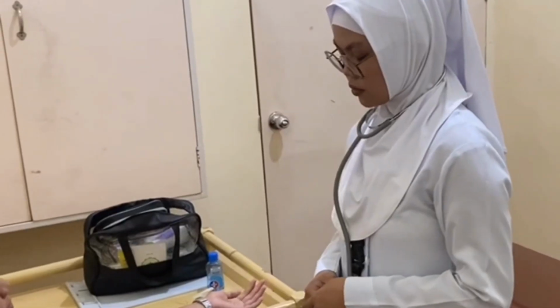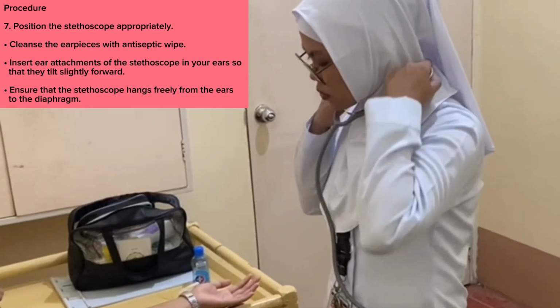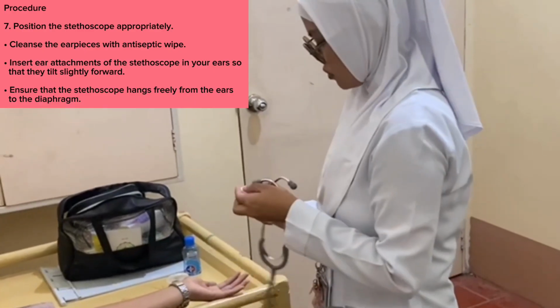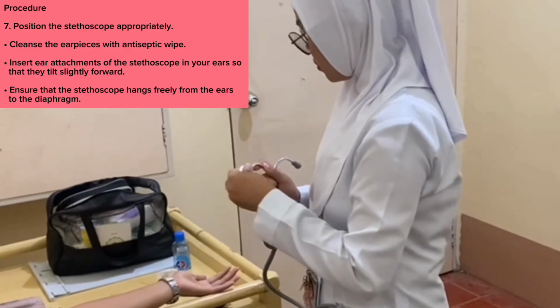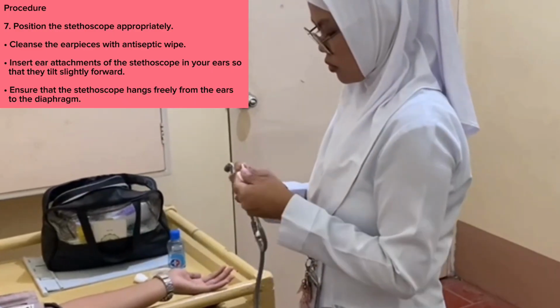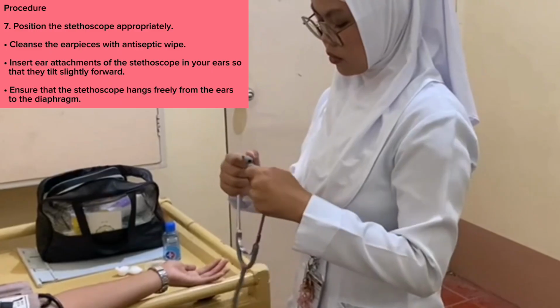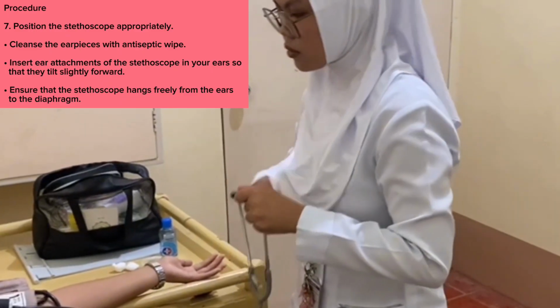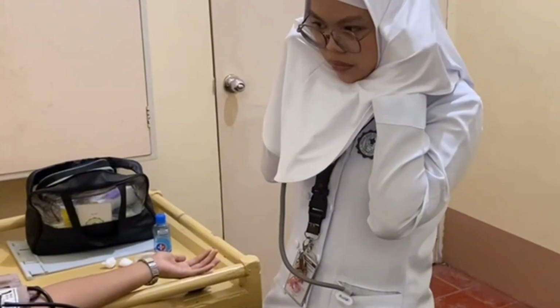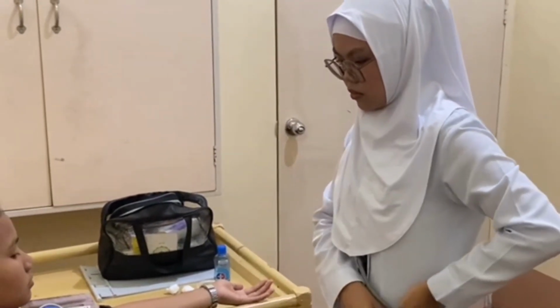For number 7, position the stethoscope appropriately. Cleanse the earpieces with antiseptic wipe. Insert the ear attachment of the stethoscope in your ears so that they tilt slightly forward. Ensure that the stethoscope hangs freely from the ears to the diaphragm.